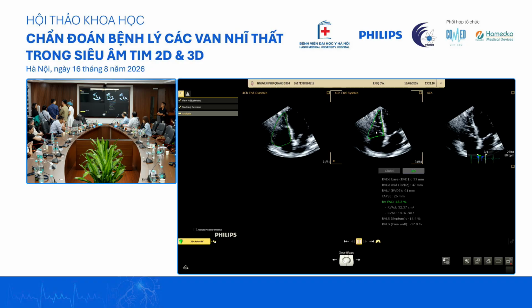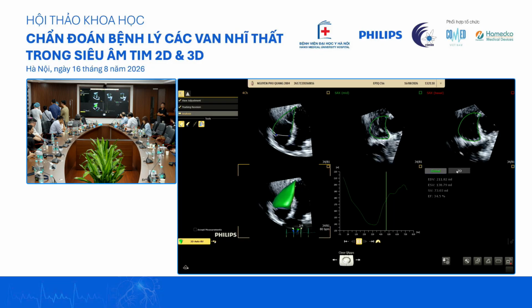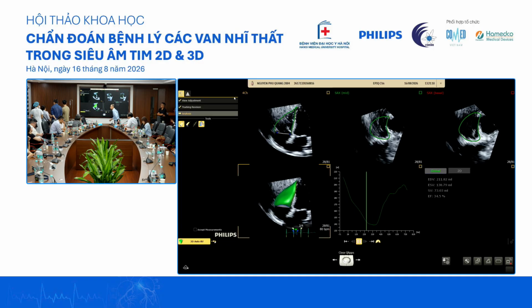Just adjust this a little bit. It's 2D, it's 3D, more reliable. So if you need, you can still adjust a little bit. This one, if it's not tracking well. This is tracking okay, but this one can be adjusted a little bit smaller. So you can also adjust the tracking.